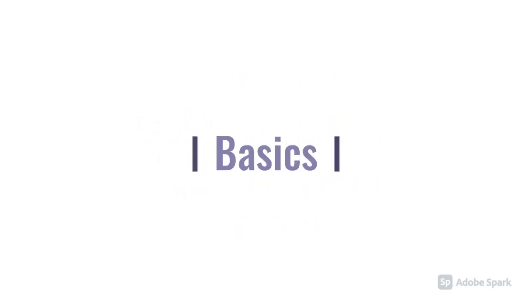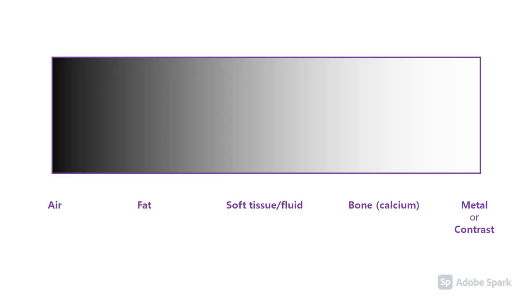Starting with the basic stuff: air is very dark on chest x-rays, and metal or contrast is very white, and then everything else is sort of in the middle. So we can work out the likely tissue or substance based on the colour of objects on chest x-rays. If something's very white — metal or bone — we say it has a high density; we might say that's an opacification or hyperdense. And if something's very dark or black, then we say that's got a low density, so hypodense.